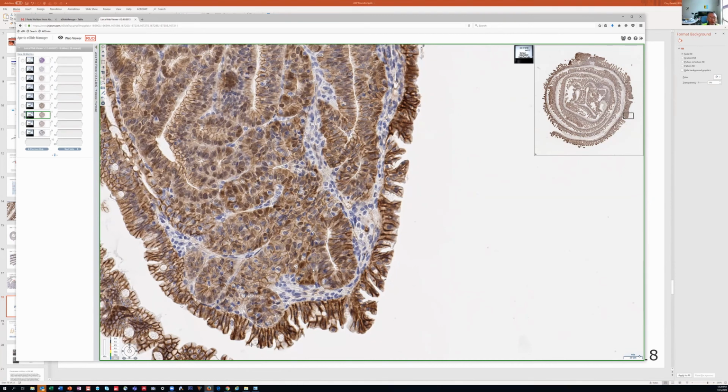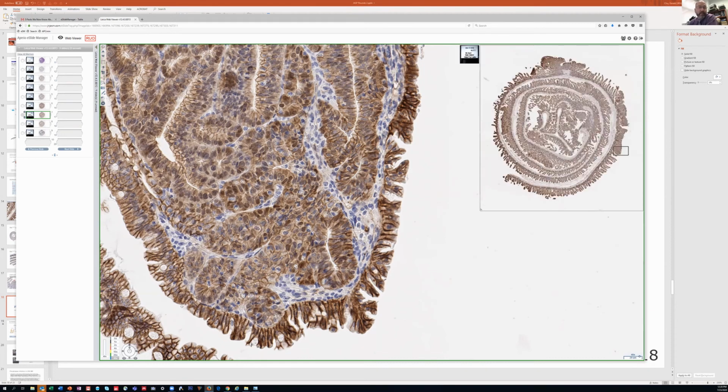I like your nuclear staining, and it's nice to see basic biology that correlates with the figures of nuclear translocation. Right. It's supposed to, when active, be nuclear. Yeah, it isn't really, though, in human adenomas entirely. You'd think with APC loss that it'd be nuclear, but I think it's usually, as it goes towards higher grade dysplasias, much more uniformly nuclear. Here you can see there is some partial along the way, but it's not what one would have imagined before you see the slides. And I don't think it's known what regulates that next step when it becomes more nuclear.